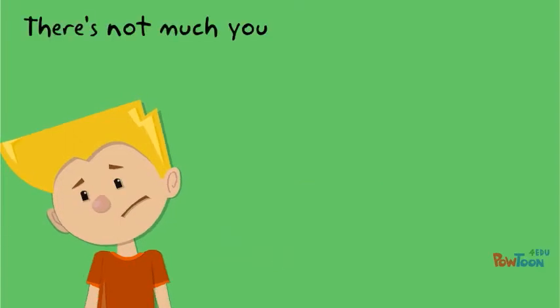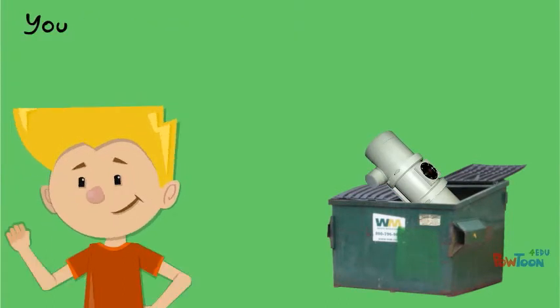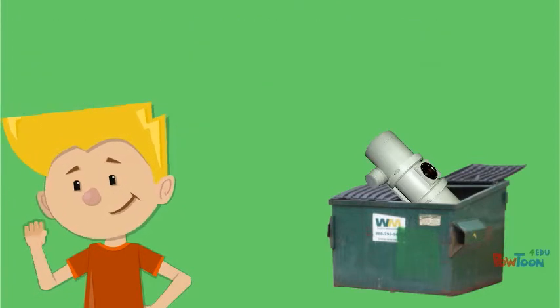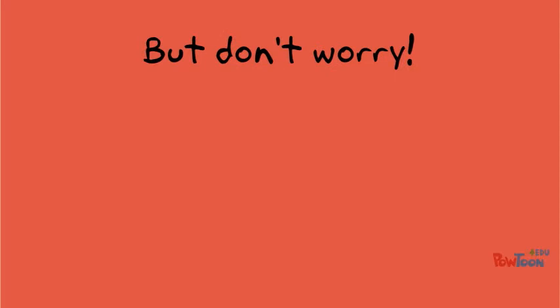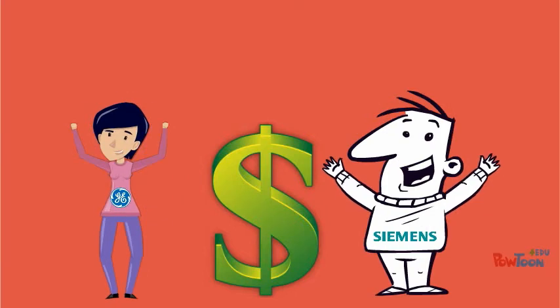There's not much you can do for an old X-ray tube whose focal spot is too blurry. You could adjust your protocols to maximize spatial resolution for your new blurry focal spot, but it won't be too long before it's in the trash. But don't worry, Mrs. G. Hey y'all! And Mr. Siemens Wiener Schnitzel will be happy to sell you a brand new X-ray system. As long as you got lots of money.